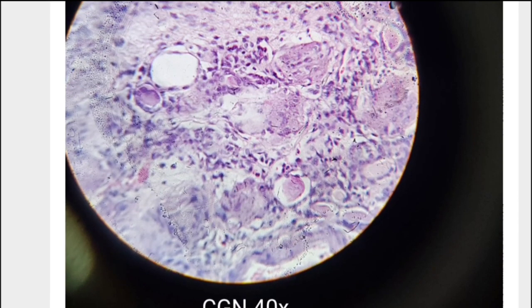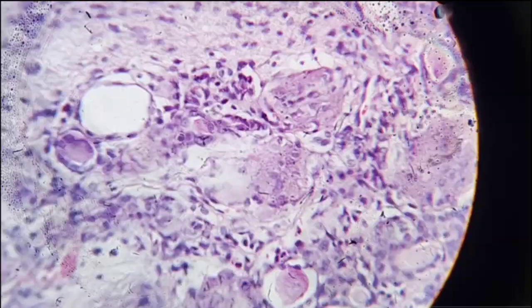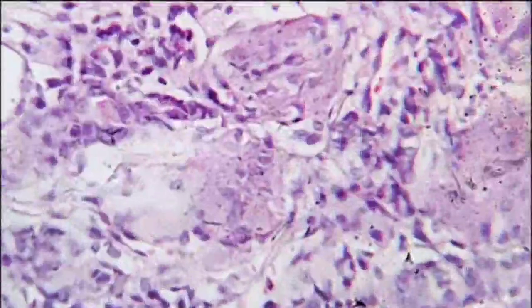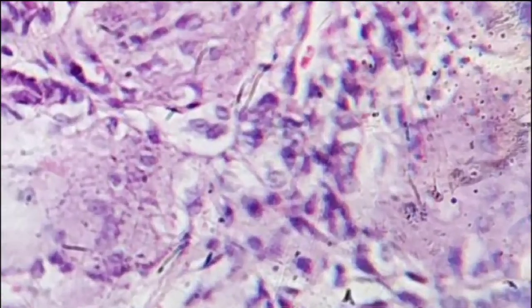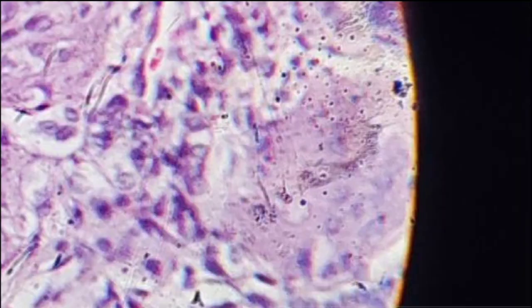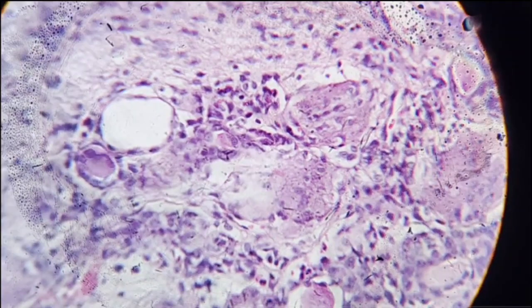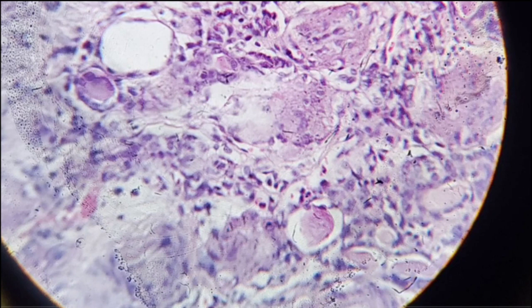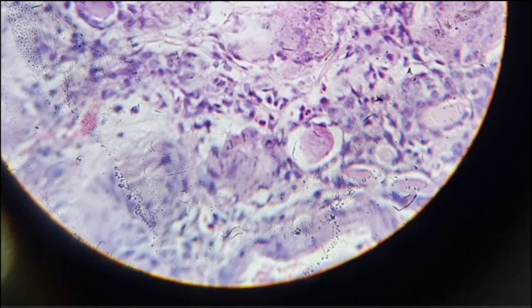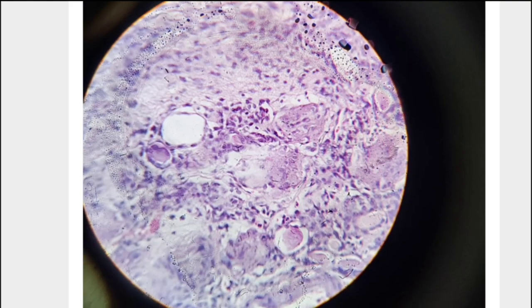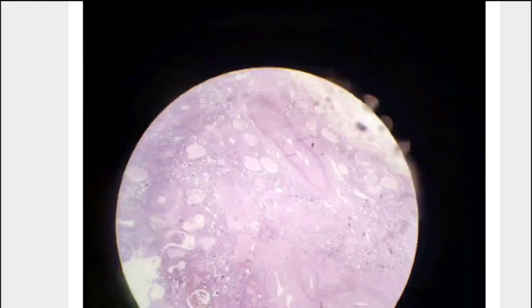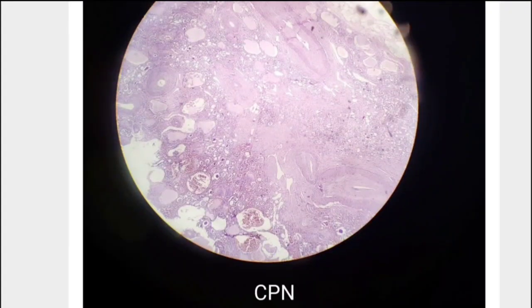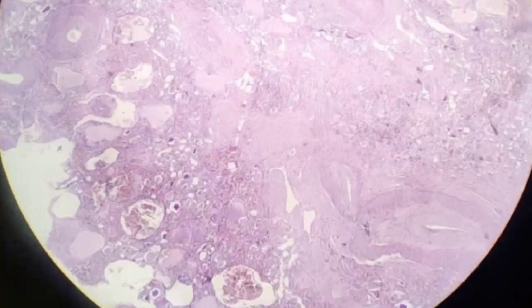At 40x magnification, you can see the atrophied glomerulus and atrophied tubules along with lymphocytic infiltration — three key findings. Chronic pyelonephritis was already covered earlier.